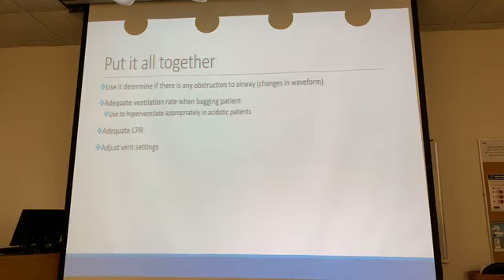Use it to grade your CPR. Okay. Make sure you're doing adequate compressions at all times and to know when it's time to switch. When that end-tidal CO2 starts dropping below 15, switch, okay? Or push harder. And use it to adjust your vent settings, okay?